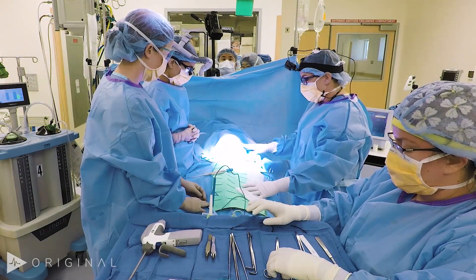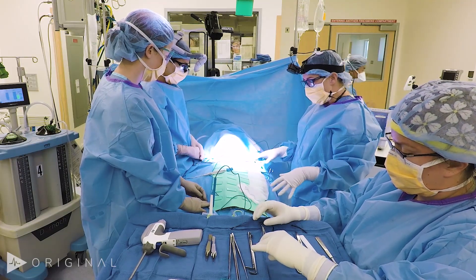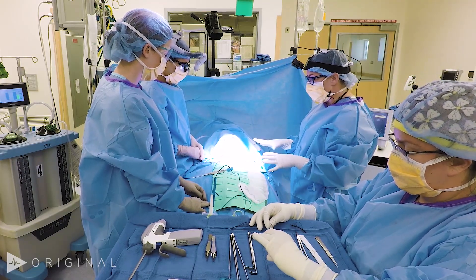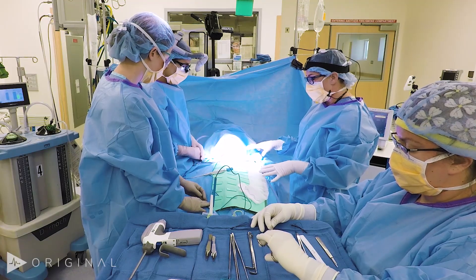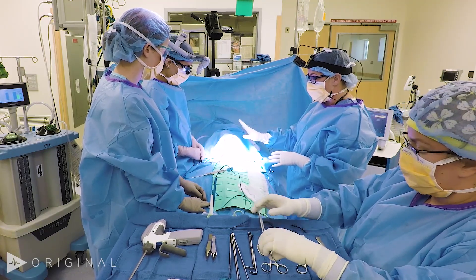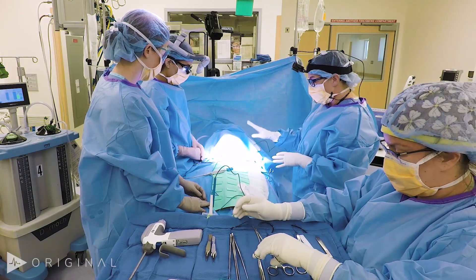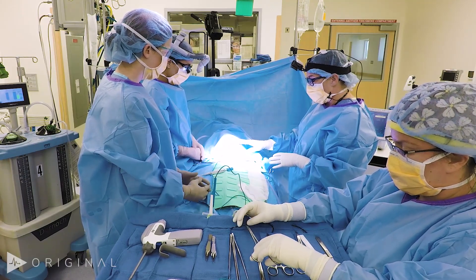Today we're going to be doing a total thyroidectomy. Before we begin, we want to review the patient positioning and some of the instruments we use. The patient is placed on the table in the supine position. Following intubation, we use an EMG endotracheal tube for laryngeal nerve monitoring, so anesthesia needs to be notified of that prior to the case so they have the right equipment.